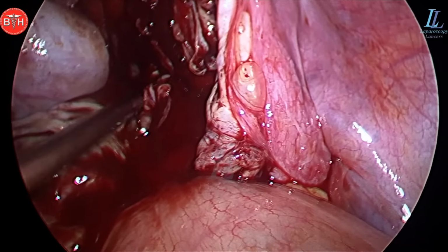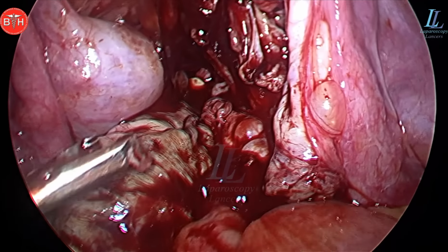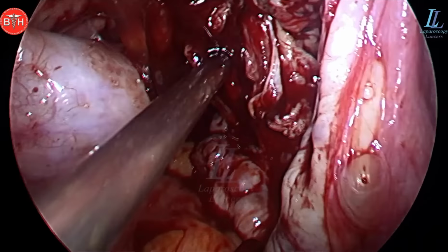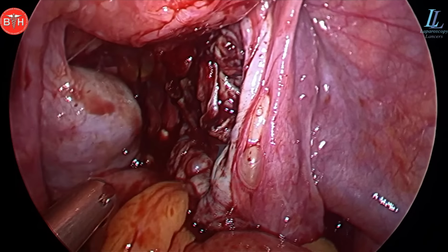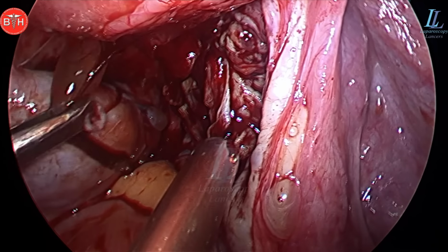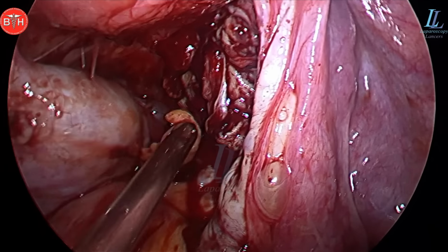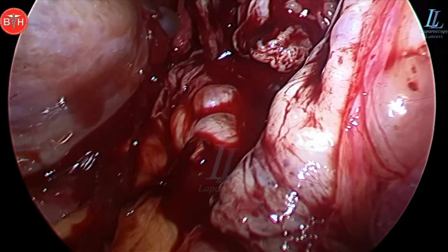Sucking is required because in the post-op these blood clots may cause pain. The thing is, it may cause pain, not always. As you must have heard and seen also, hemoperitoneums do not cause any pain. So do not be so aggressive with the surgeries, and those yellow things are due to chronic inflammation. Those honeycomb like things, gelatinous things, sucking them a bit, that's just a time pass, nothing more.